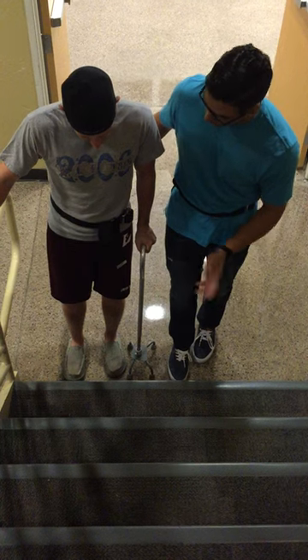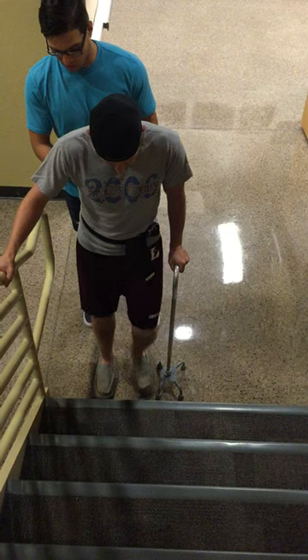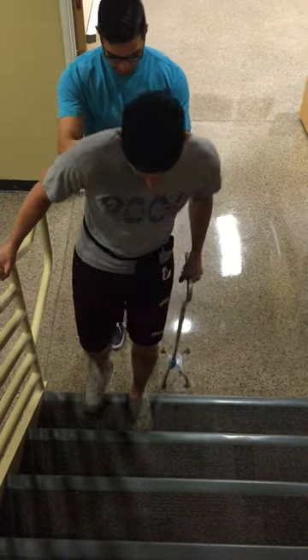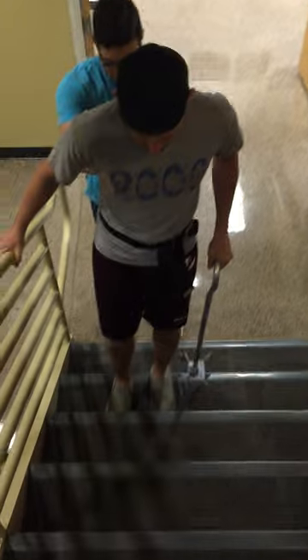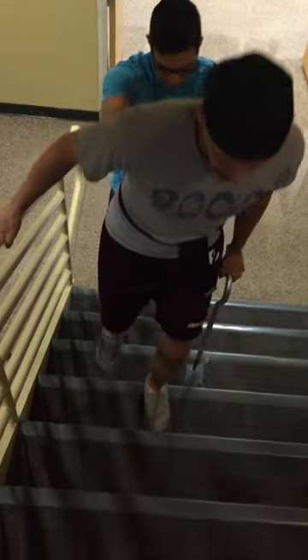If you start to feel like you're losing your balance or anything, stop and slow down. Alrighty, we're going to get going here. So go left — there we go — right and up. Perfect.